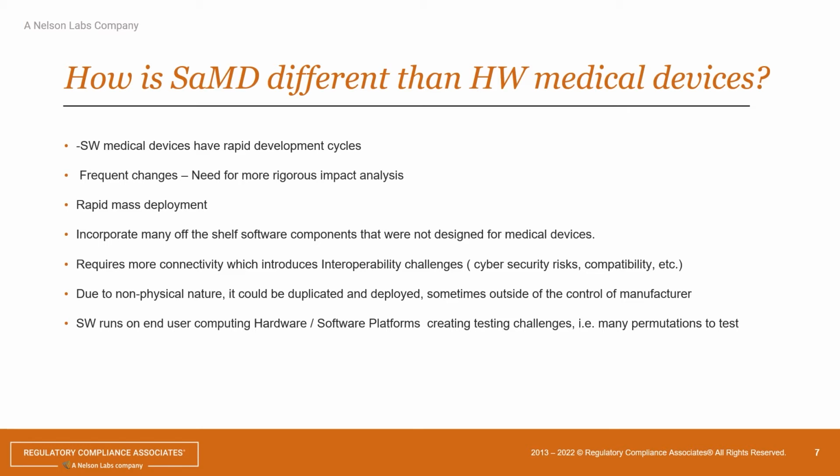Then another thing, as we talked about, is that software as a medical device typically takes input from something. If I'm getting my images from PACS systems, then there's an interface right there for the input to come in. I do my algorithms, whether they're AI or any other algorithms that I apply, and then convert it to something else. That output might also go to another system.